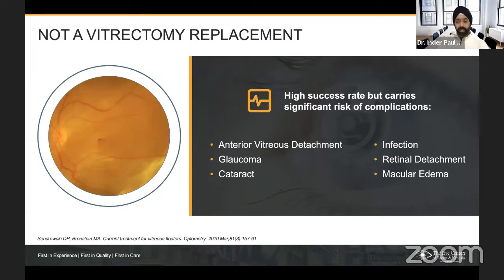Vitrectomy is a fantastic procedure, but for a lot of our patients with a Weiss ring or with solitary masses and floaters in the vitreous, let's say phakic and younger, a lot of our colleagues who do vitrectomy surgery won't want to do a surgery on those patients because of the risks. Although the risks have gotten much better, we still see a risk of cataract formation, detachments, and other risks. So a lot of our patients who end up getting vitreolysis are not great candidates for vitrectomy as well. They're a different type of patient pool, which is why I think the two are synergistic with each other.